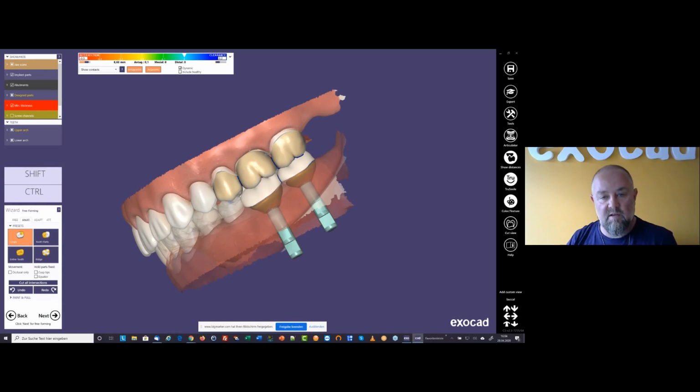So to make sure that if you have a scanner which is able to transfer the physical position into digital, to make sure that if you adapt the occlusion digitally, you will have exactly the same result later in your physical articulator, and you will not have any conflicts anymore in the occlusion when doing the movements.